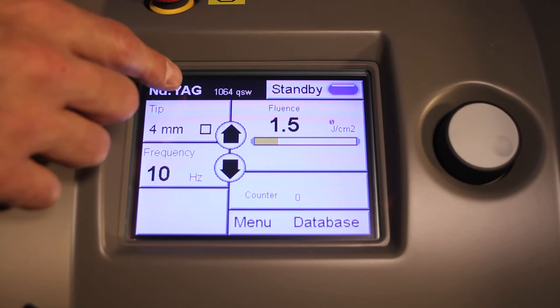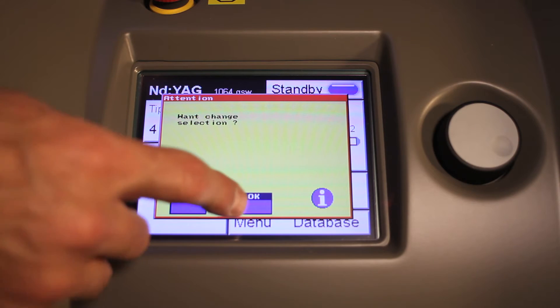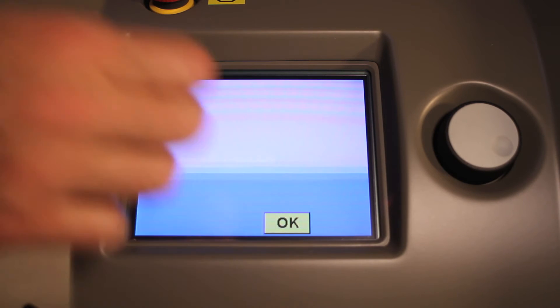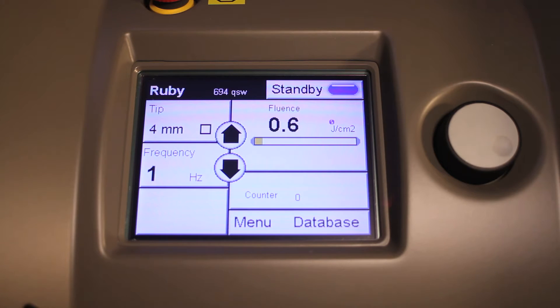To go to a different wavelength, you just hit where the wavelength shows. It's going to ask if you want to change your selection — select OK. For example, if you want to come over to the 694, hit OK. It's approximately a 30 to 45 second power up. All wavelengths are able to utilize all handpieces: the 2x2, the 3x3, the 4x4, and the newest handpiece, the 5x5. And that's how long it takes to switch from 1064 to 694.